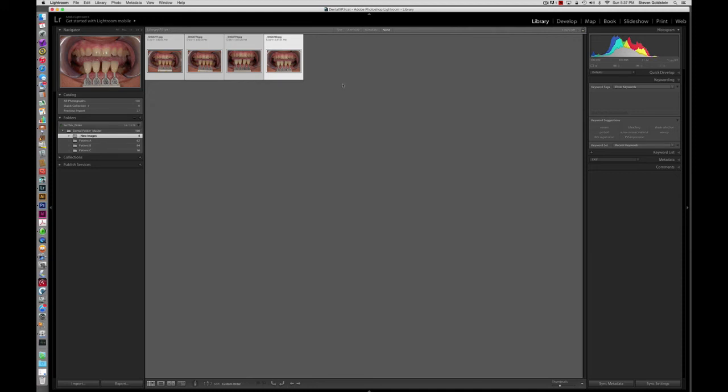And again, let's say this is a new patient, and I want to keyword them. So I would select them all. Let's say shade selection. I'm going to click this here. And they're all keyworded now with a new tag. Now, what I want to do is add these images to a new patient folder.